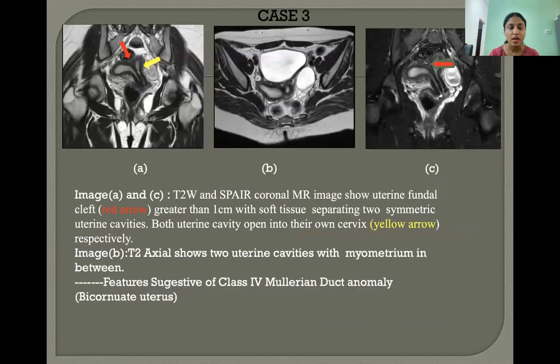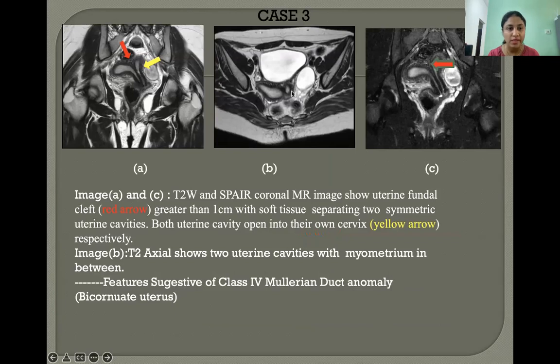Case 3: Image A is T2 weighted and image C is a coronal MR image showing a uterine fundal cleft greater than 1 cm with soft tissue separating two symmetrical uterine cavities. Both uterine cavities open into their own cervix respectively. Image B is T2 axial, showing two uterine cavities with myometrium in between. These features are suggestive of class 4 Mullerian duct anomaly.